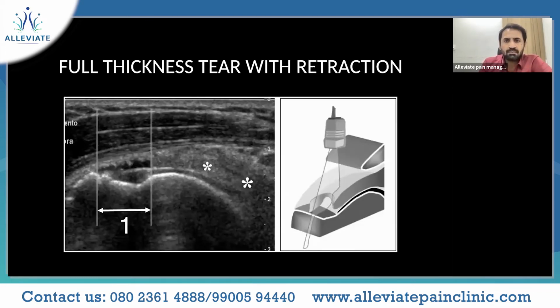This basically is a full thickness tear with retraction, and you also put measurements in your long and short axis, the length as well as the width. This is how you calculate. So whenever we are doing a scan, it's important for us to not only look at one area of the tendon, but it has to be a scanning of both anterior, posterior, the width and the length, both have to be checked.